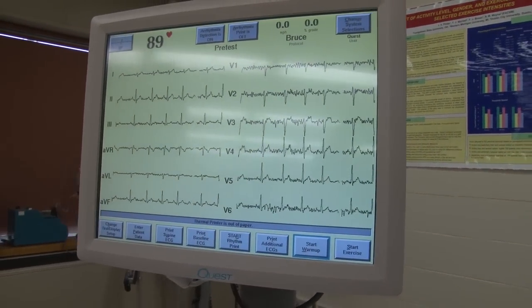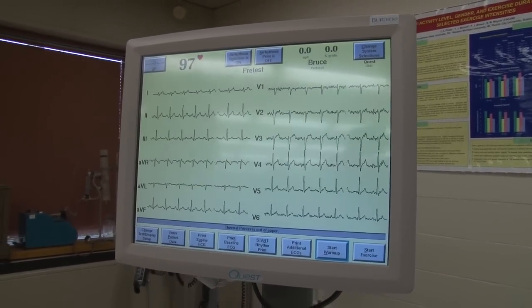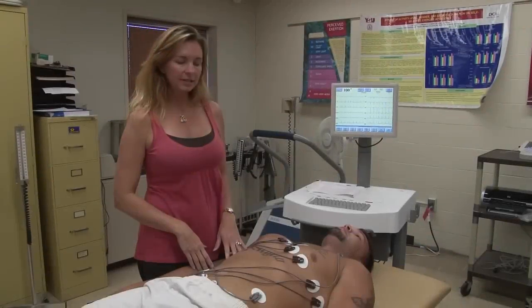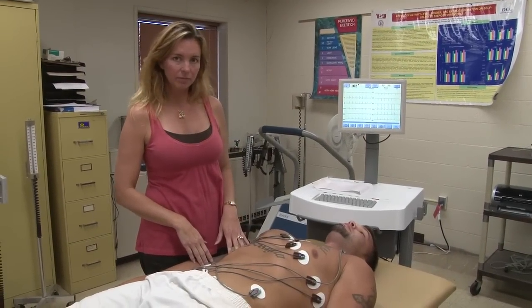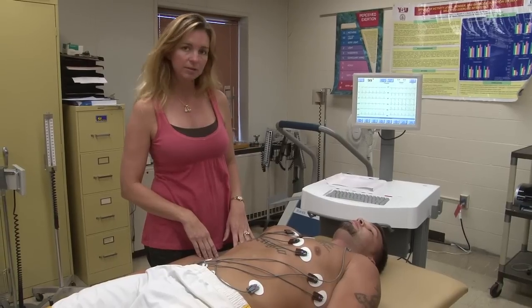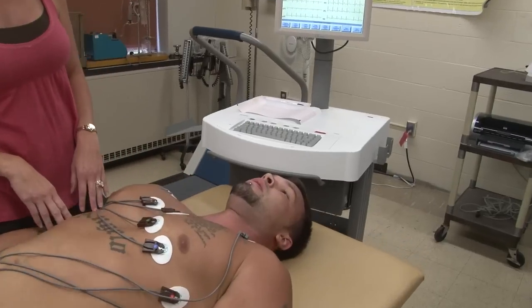This is exactly what we mean by artifact. This is a lot of noise in the EKG, and it makes it difficult to interpret. What happens when you have artifact is it can confuse the clinician to determine whether this is a positive test or just a false positive test. So we always want to make sure our client is relaxed. The next thing that we're going to demonstrate is hyperventilation. Now, what I'm going to have Jake do is breathe real heavy for about 30 seconds, and we're going to see what changes occur on the EKG screen. So go ahead and start, Jake.